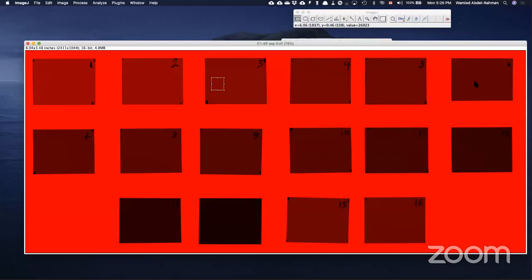So my recommendation, if you have an old batch of GafChromic films, I think you just have to be careful with this orientation. If you don't know, just test it: scan a film, take an image, rotate it 90 degrees and scan again and see, are the signals different or not? I heard you can get up to 5-7% difference in signal between the two orientations.